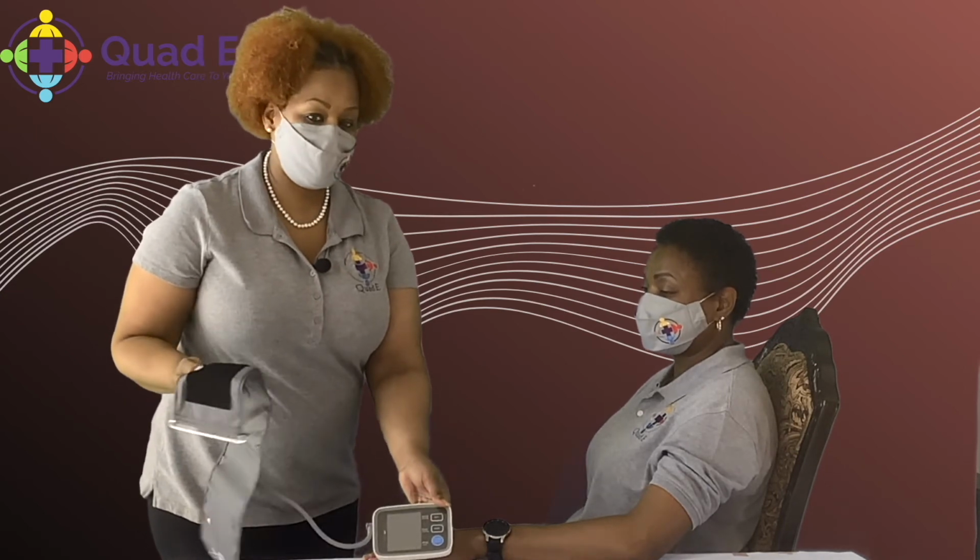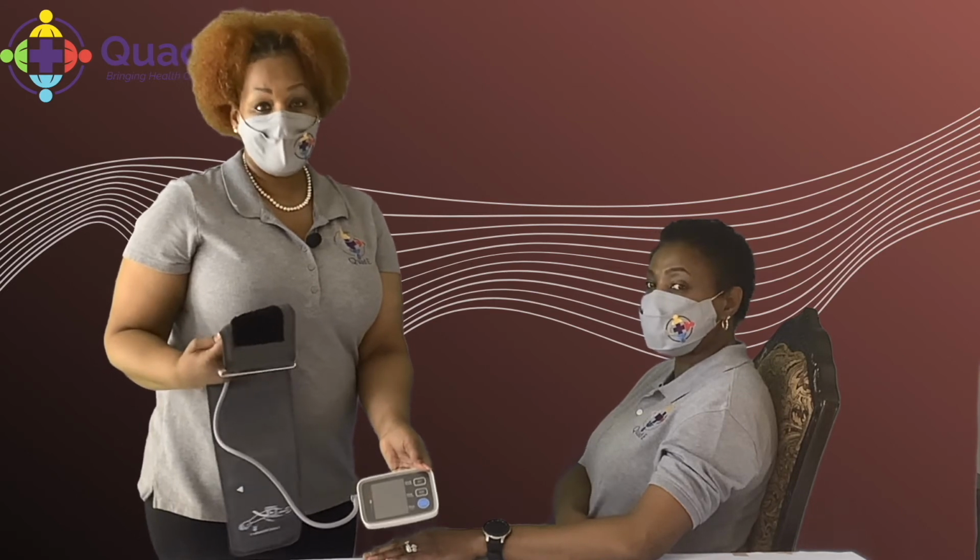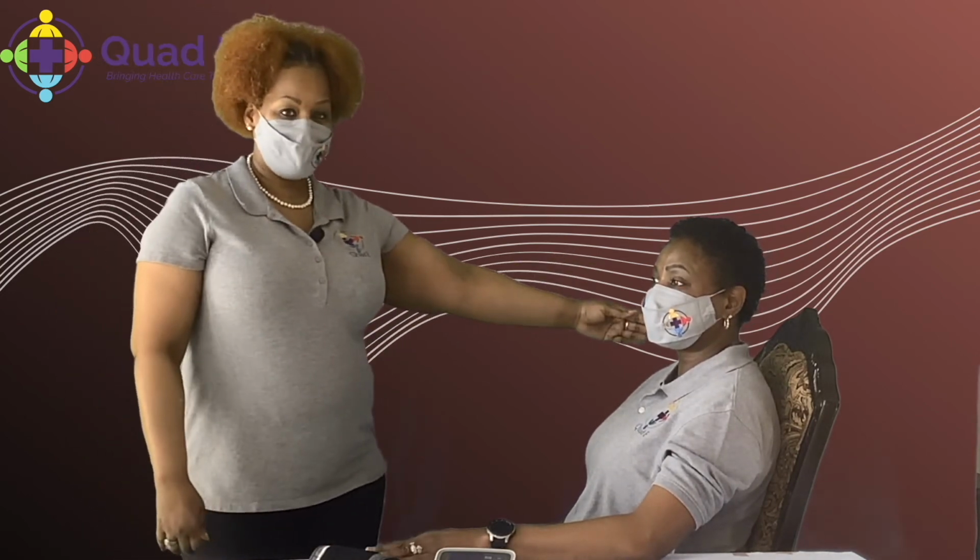All right, so I'll be using the blood pressure cuff that I mentioned before, okay? We don't need a stethoscope. The only thing we need is to make sure that it is operational. And you want to make sure that you're going by the directions that are included with the blood pressure cuff that you have, okay? So again, Miss Jeanette is sitting in a chair, and her back is fully against the back of the chair. And you can't see it, but her feet are flat on the floor. The ankles are not crossed, the legs are not crossed.